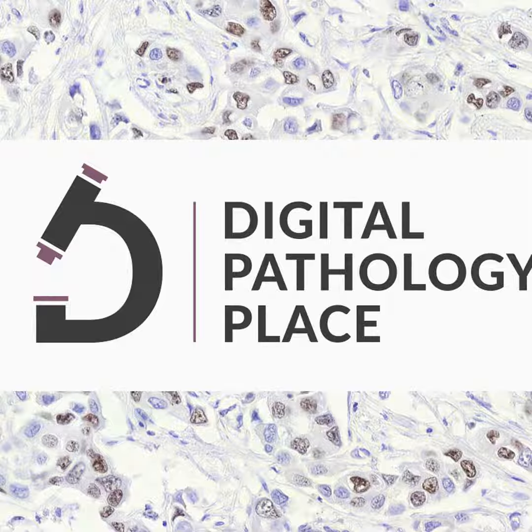A little bit to add to that. Remember, the feature list was pre-specified. Now, some of those features might be in the actual cases. Some might not be. Some may never be, right? The cases in the accuracy study are really designed to be kind of consecutive, a broad representation of what a pathologist in general practice would see with respect to primary diagnosis.